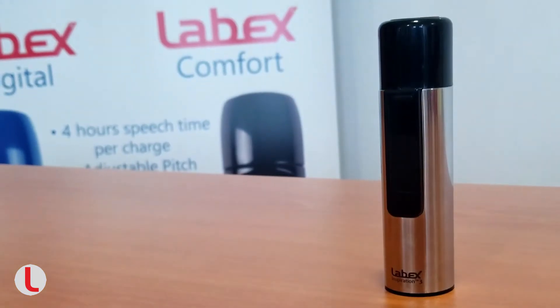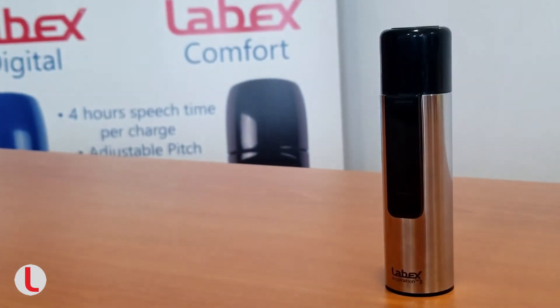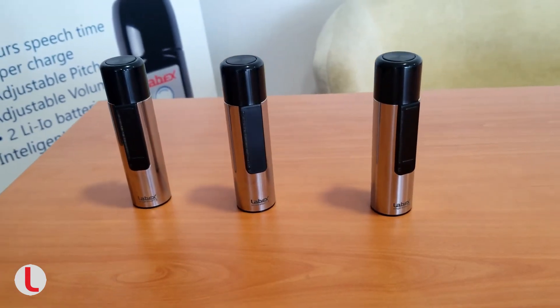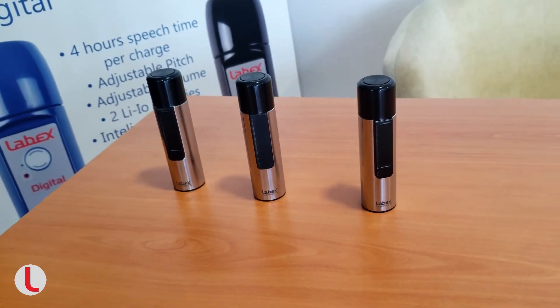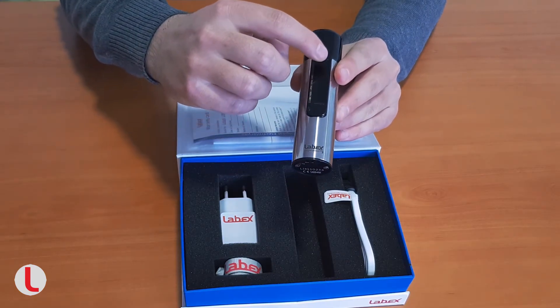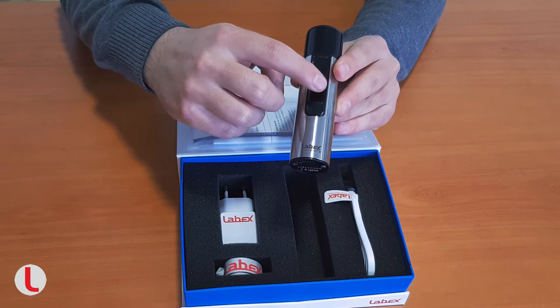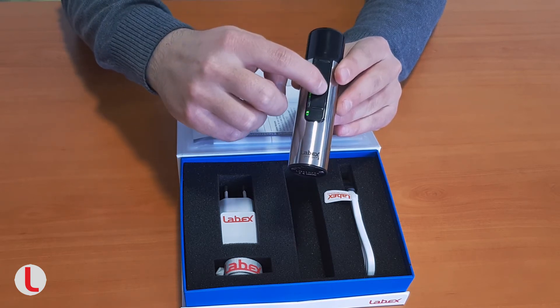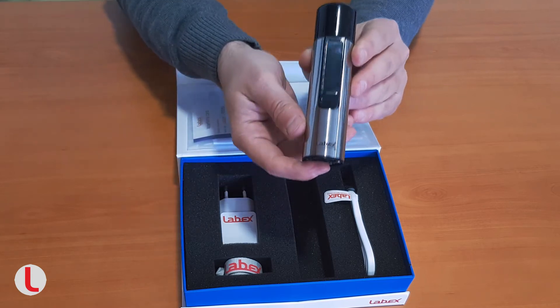The Inspiration can be configured to work in different modes, which will be presented later in this video. However, the daily usage is reduced to three main functionalities. Speak and change the pitch while talking by sliding on the touch panel. Touch the panel to start the sound and slide on to change the pitch. Release to stop the sound.